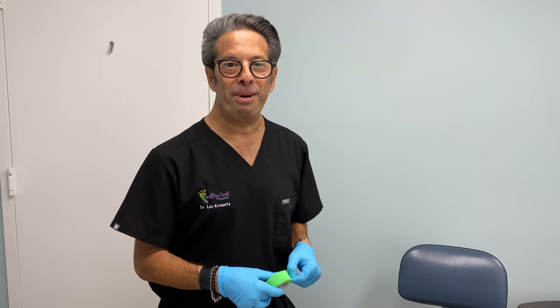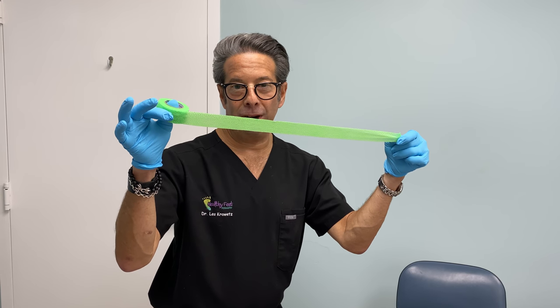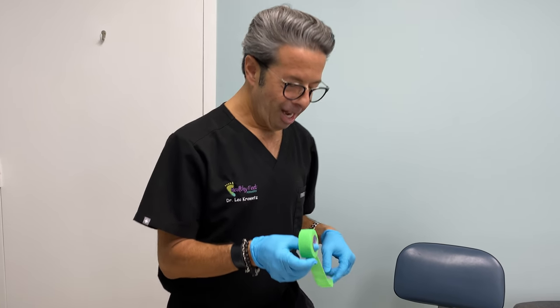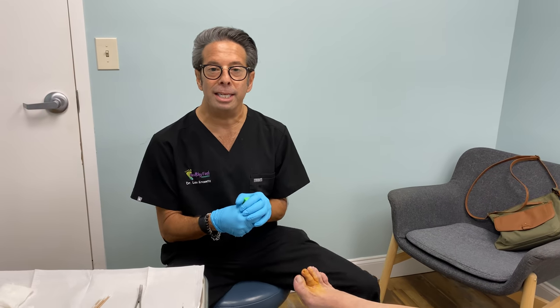Hey everybody, Dr. Leo Proud, it's Healthy Feet Podiatry. Coban — you know what this is for? This is a tourniquet. We use our Coban as a tourniquet. And I've got a special case today.